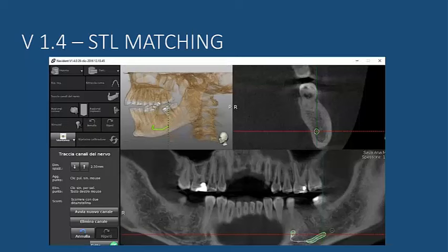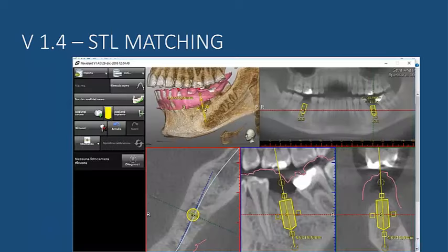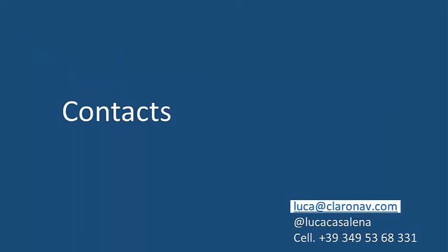Other features include the ability to draw nerve canals using the sagittal view alongside the panorex, and as previously seen, you can also plan implants using the 3D quadrant. That's it — thanks for your attention.